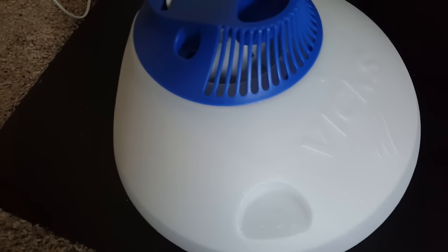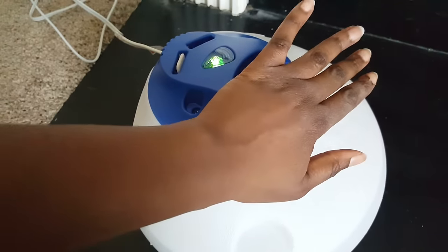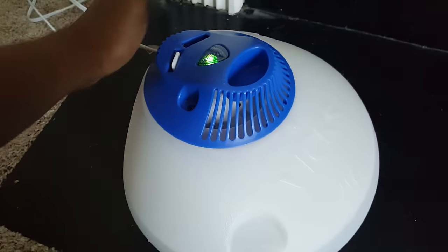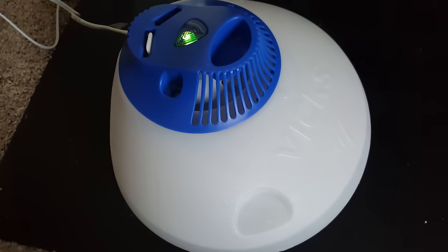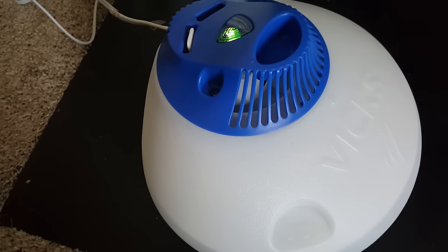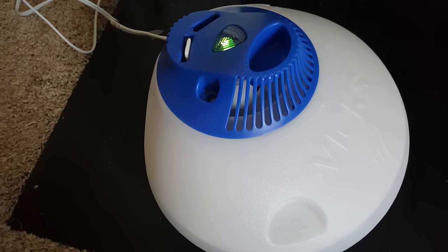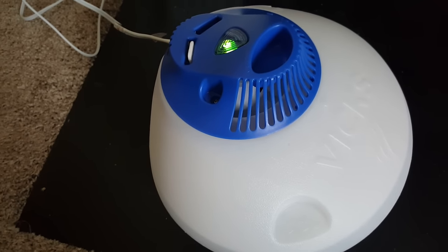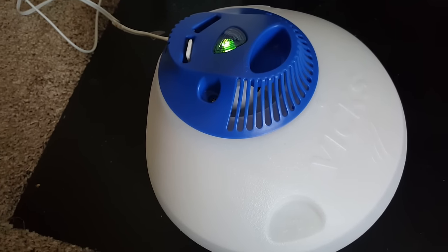I believe I see something coming out of this. I'm going to wait a bit more. If you have one of these and the steam is not coming out, you need to add a pinch or two of salt. That's what I'm going to do.